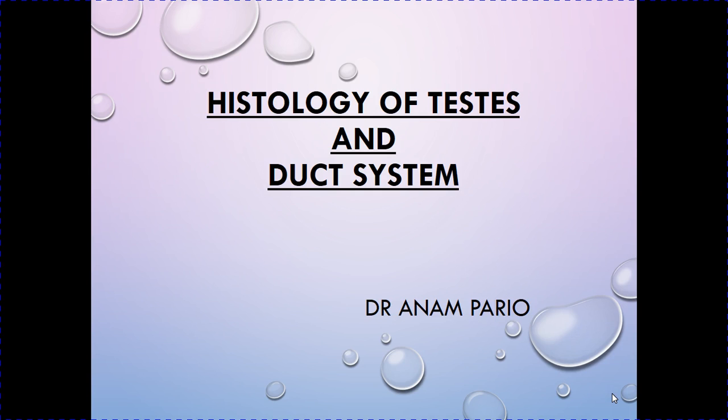Dr. Anam Pario, and today we are going to learn histology of testes and ducts. The lecture was taken by Dr. Suraya, and in this video I am going to describe the microscopic features. I am going to show you the microscopic images of the testes and the ducts present in the male genital system.